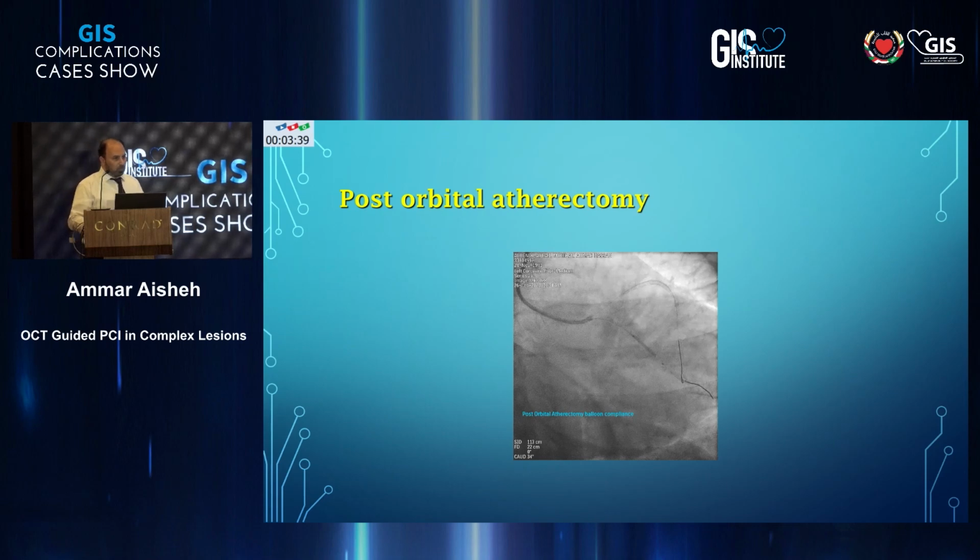So in this case, if you already had the OCT catheter on the table, you did CSI, even before you take the balloon up to see if you need to do more atherectomy. The problem with CSI sometimes is the feedback. It takes a lot of experience to know when is enough atherectomy. Because the worst thing is you do atherectomy, you take up the balloon, and it's not expanding. With rota, with the deceleration, the sound of the rota, how the burr goes, maybe it gives the operator more tactile feedback to get an idea, did I ablate enough or not?